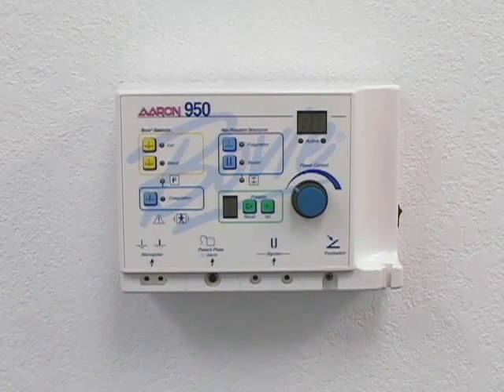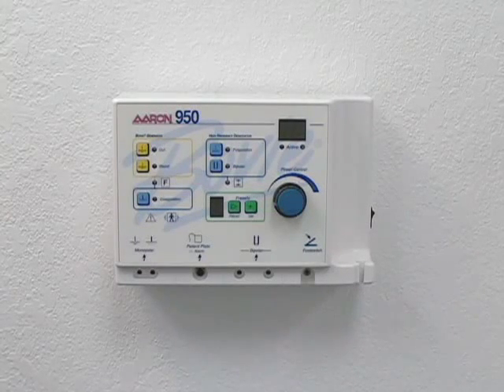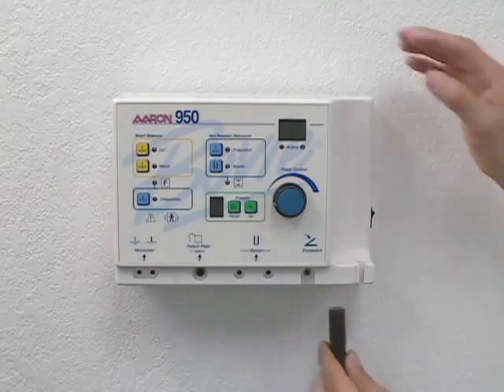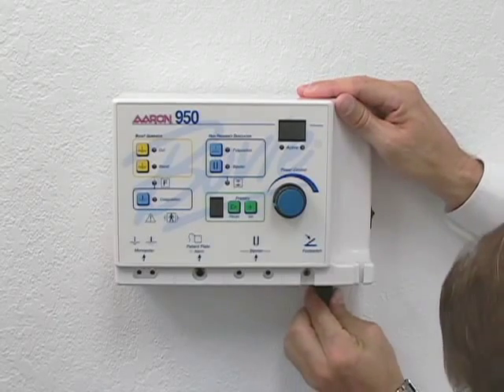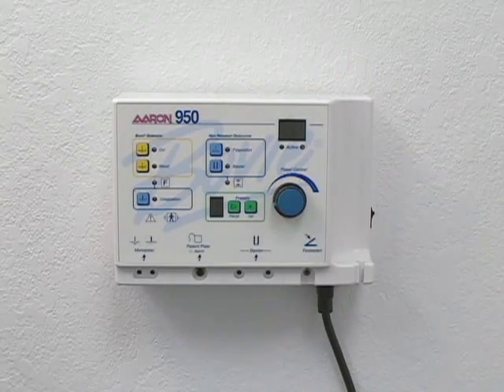Before operating your unit, be sure to read and understand all safety warnings and cautions referenced in the user's guide. After the ARIN 950 is properly mounted on the wall, ensure that the power switch is in the off position. Plug the hospital grade power cord into the unit, and the other end into a properly grounded AC outlet.